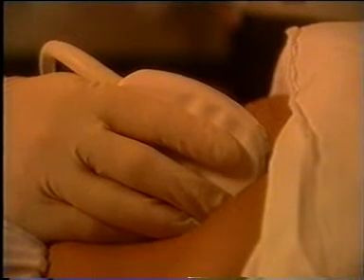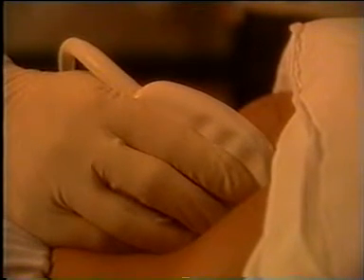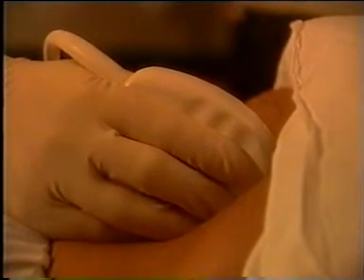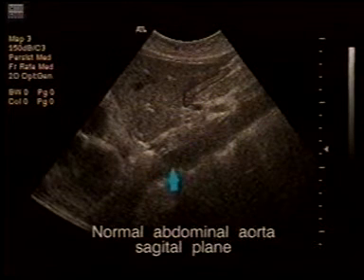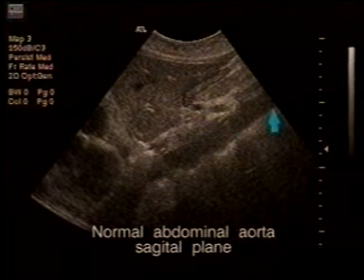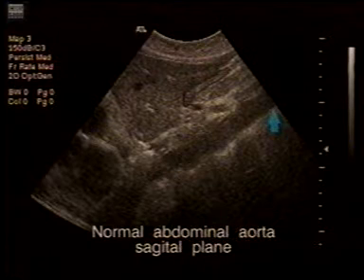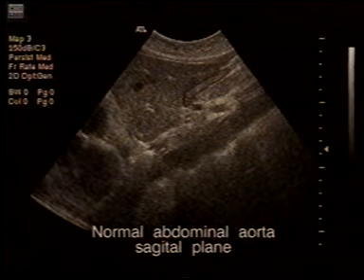In obese patients, this may be quite difficult. You may have to press quite hard and try scanning more on the right side of the body. A normal abdominal aorta looks like a straight tube with a black hole in the middle. It is usually about 2 centimeters in diameter. We do not talk about an aneurysm until the diameter is 3 centimeters or greater.